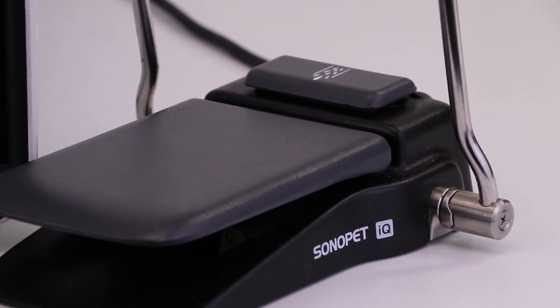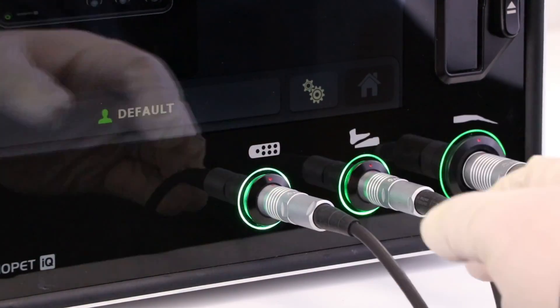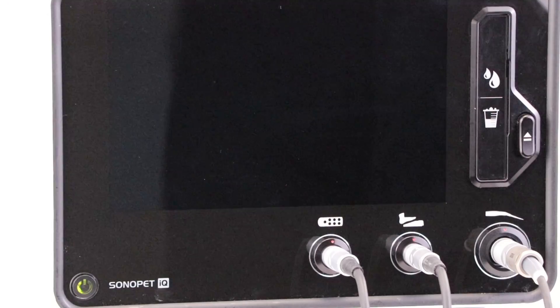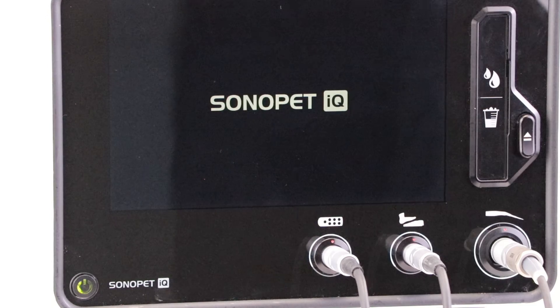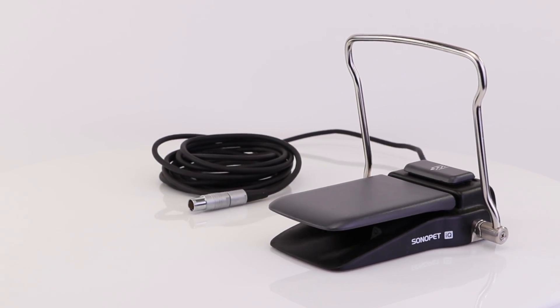The Sonopet IQ uses Stryker's proprietary longitudinal torsional technology. It couples longitudinal torsional vibrations for 25,000 times per second non-rotational motion that cuts bone without affecting soft tissue. It also emulsifies hydrous soft tissue like tumors and fat without impacting vessels, nerves, or tendons.